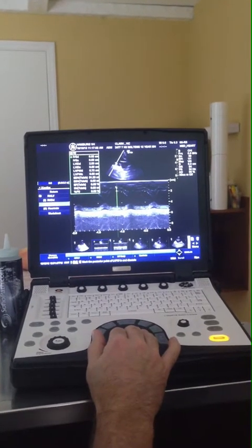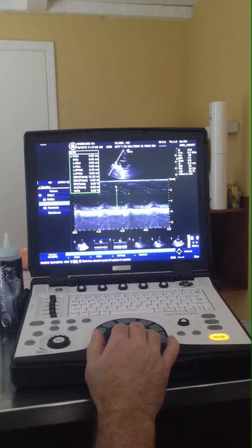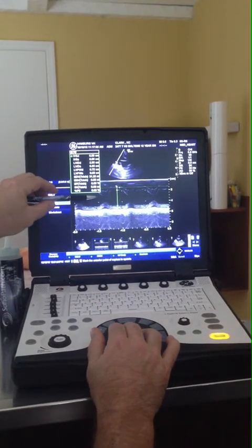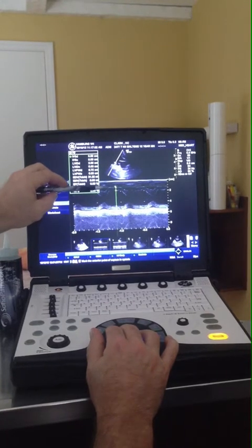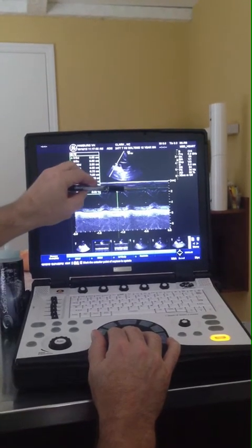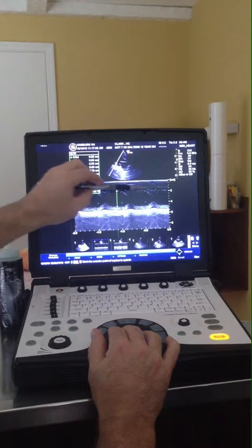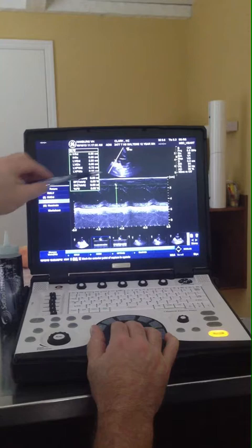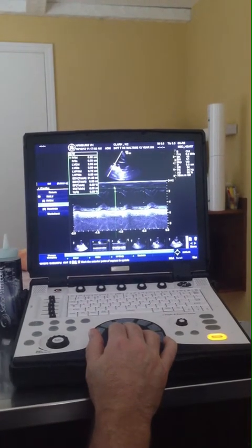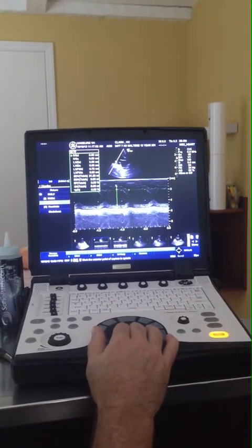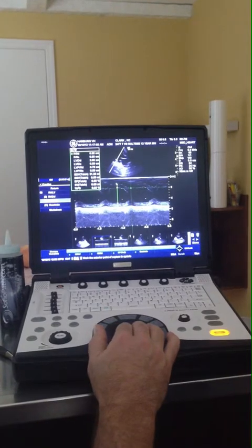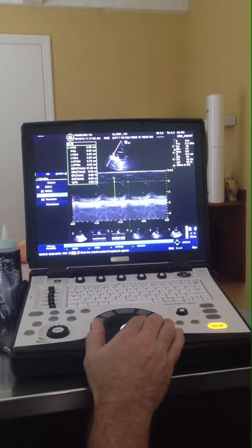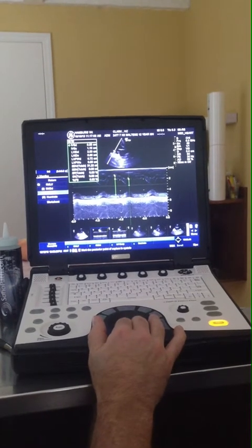Then free wall, then systole. If we have an area we want to measure and it isn't all that clear, we just follow the horizontal line to see where the leading edge should be. We can use that position based on where the following contractions are. After diastole, we go to systole — the systolic point is going to be lower than the diastolic point — same point on the leading edge of the septum in systole to the peak.